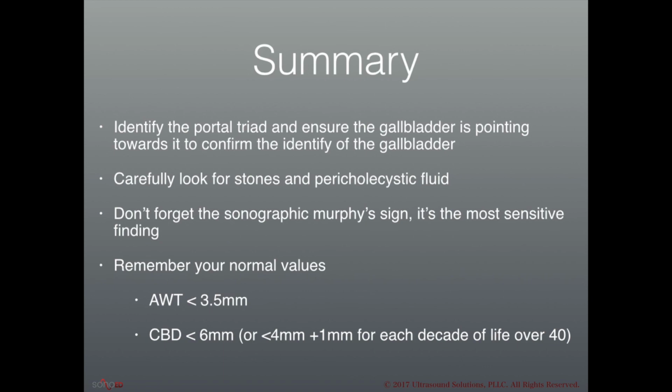So in summary, remember to identify not only the gallbladder but the Portal Triad, carefully look for stones and pericholecystic fluid as you scan through the gallbladder. Don't forget to ask the patient if this location, as you press over the gallbladder, is their maximal location of pain, as the sonographic Murphy sign is the most sensitive finding in cholecystitis.